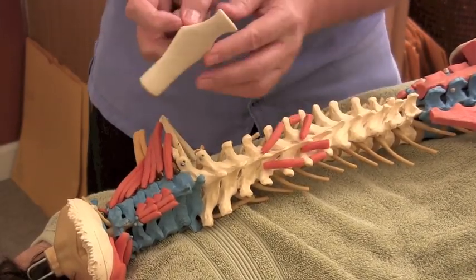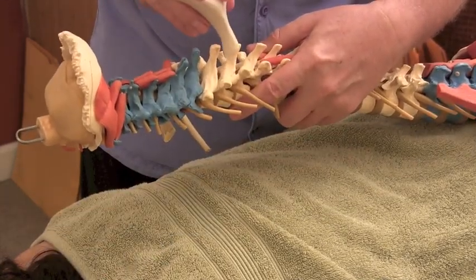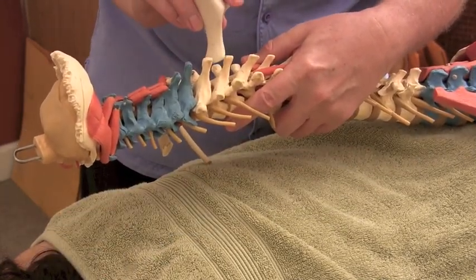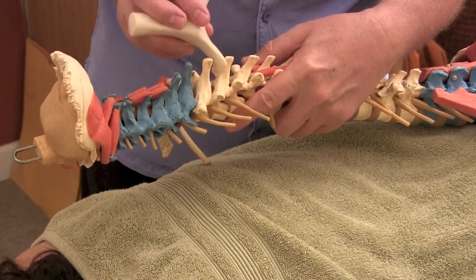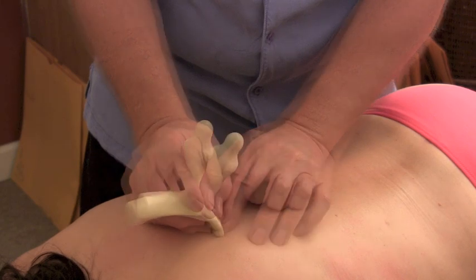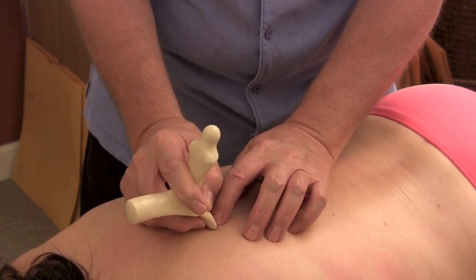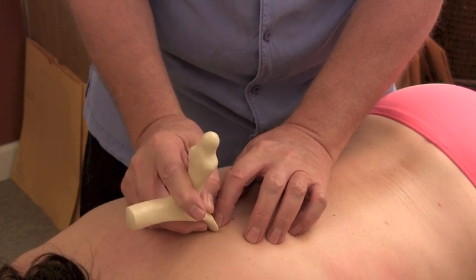You can work through there. Then you can take the little tool and work right in between the spinous processes. There are little muscles, little ligaments, little tendons, and you can see I can go right in between the vertebrae. You want to work through, on some people, each and every one of these little areas and work them through.